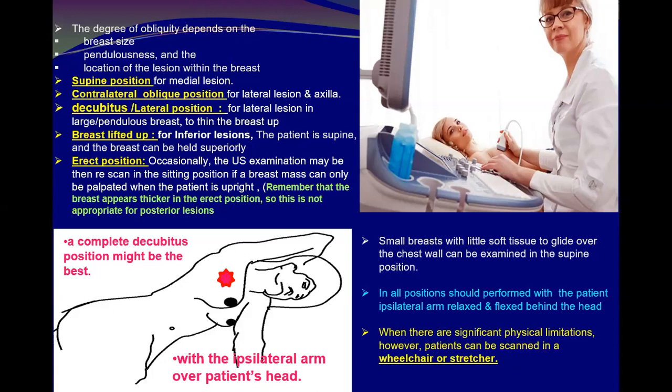But if the breast is pendulous, or a huge breast, then you might need to put the patient in the lateral decubitus position to evaluate the laterally located lesions.